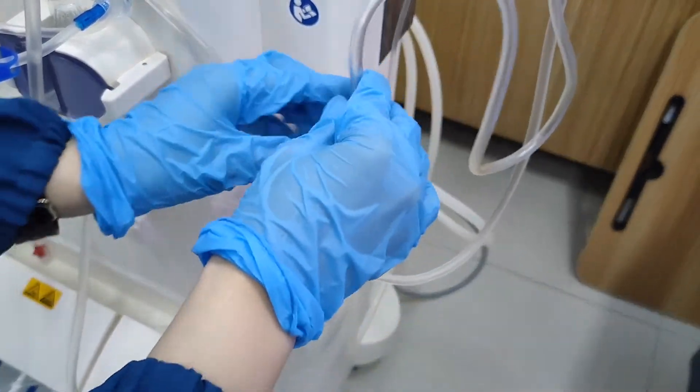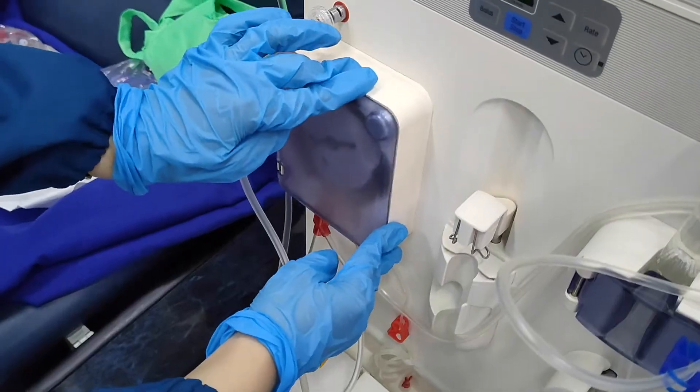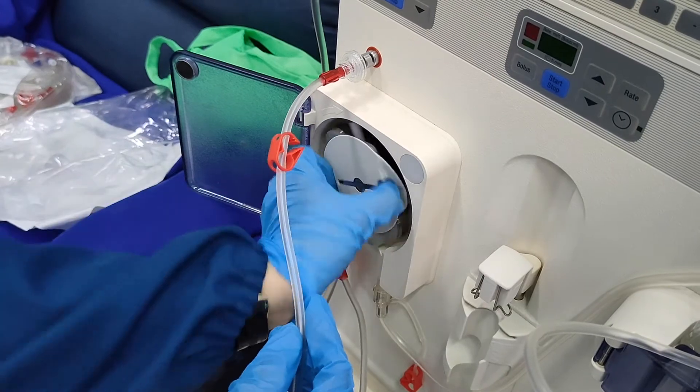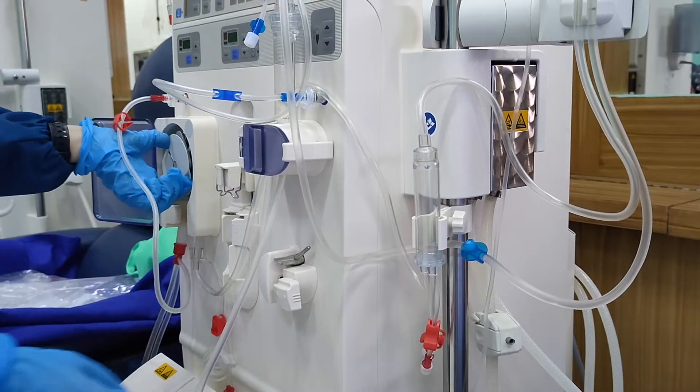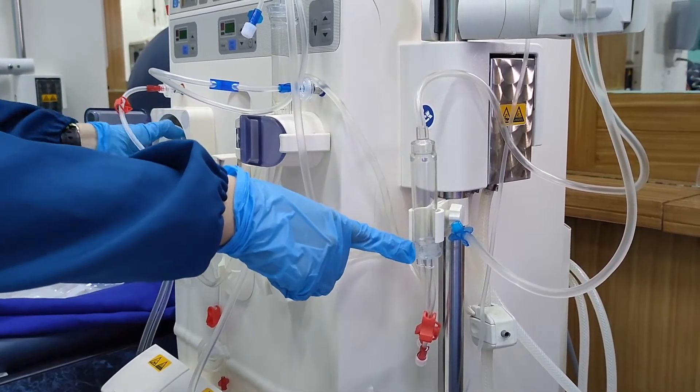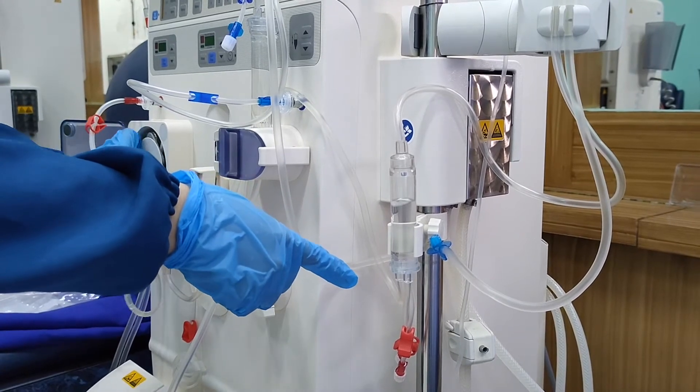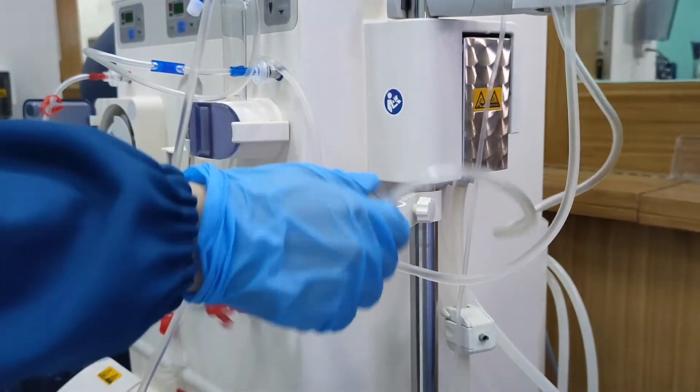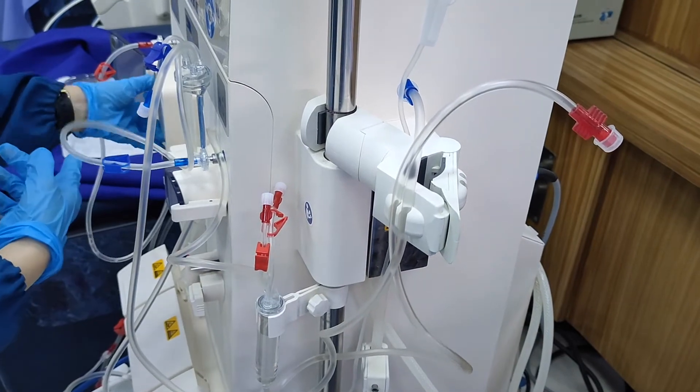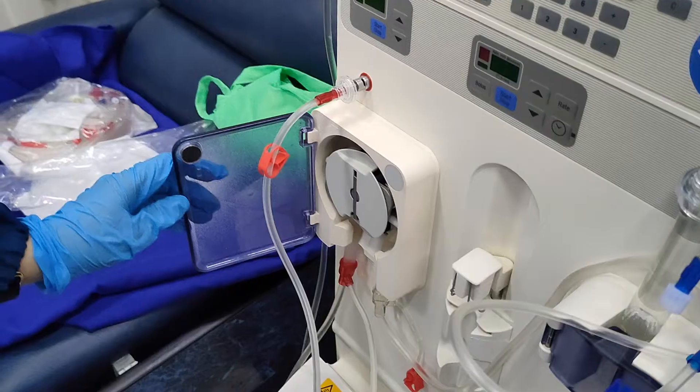Next, invert the arterial chamber. Then, manually turn the blood pump until the arterial chamber is three-fourths full. After the arterial chamber is three-fourths full, place the arterial chamber upright. Then, continue to manually turn the blood pump until the dialyzer port is filled with NSS.